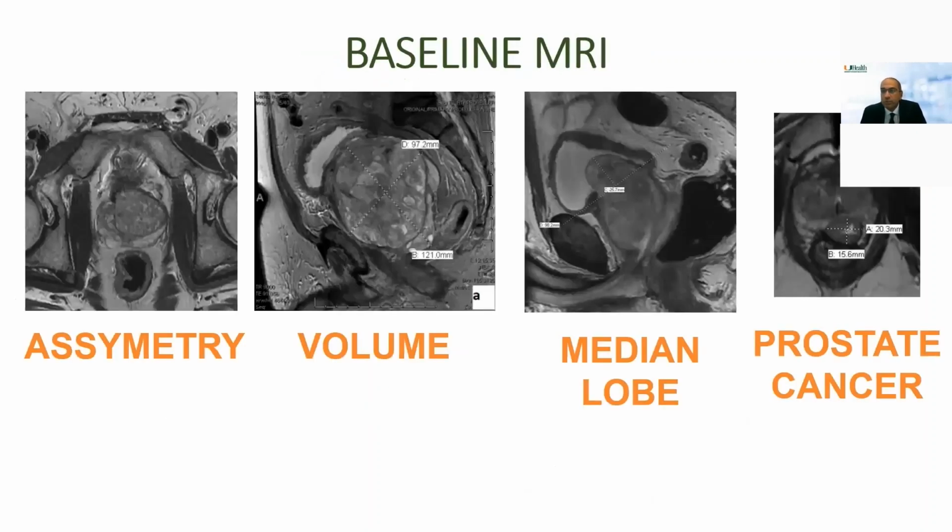Baseline MRI. So we do baseline MRI. You know, our background is interventional radiology. We like to see, but now I think the latest AUA guidelines do include baseline prostate size and shape, which was not the case before 2018. But we'd like to do MRI for a lot of different reasons.